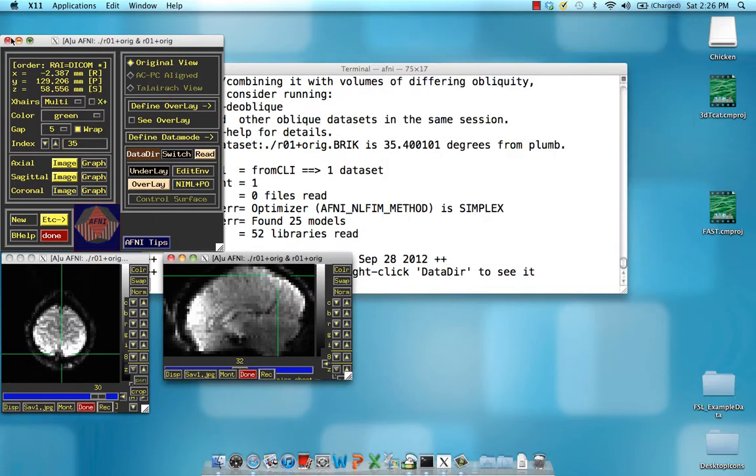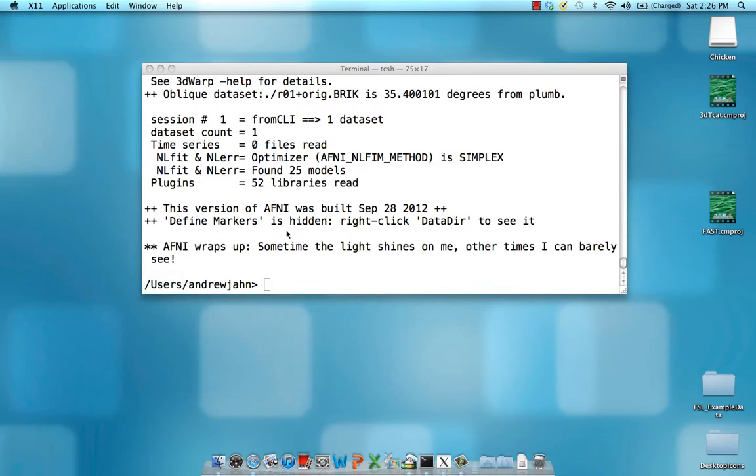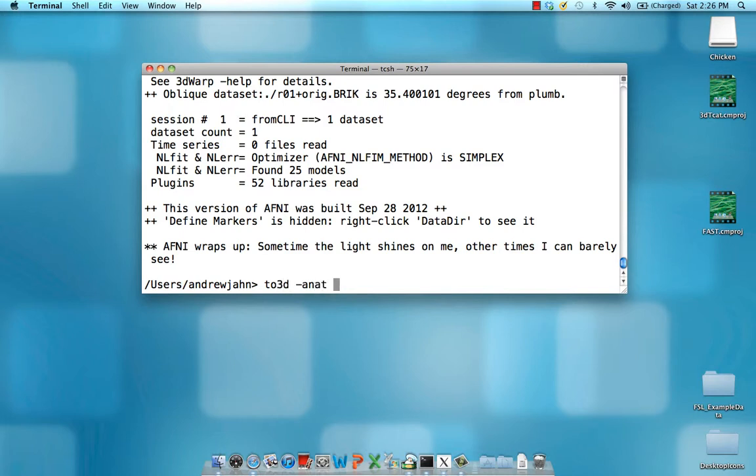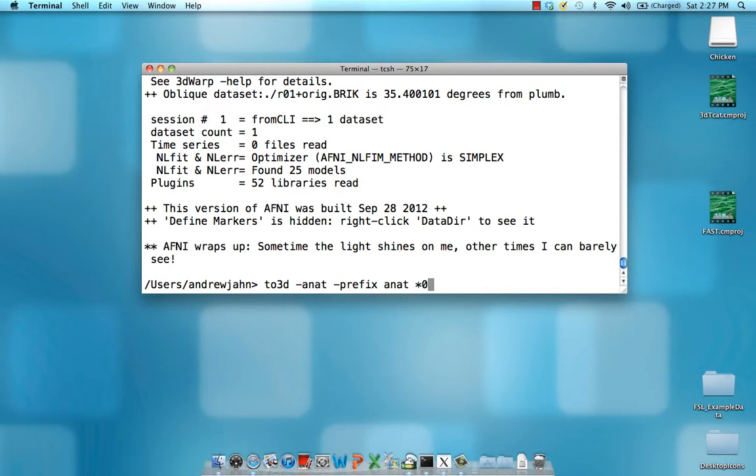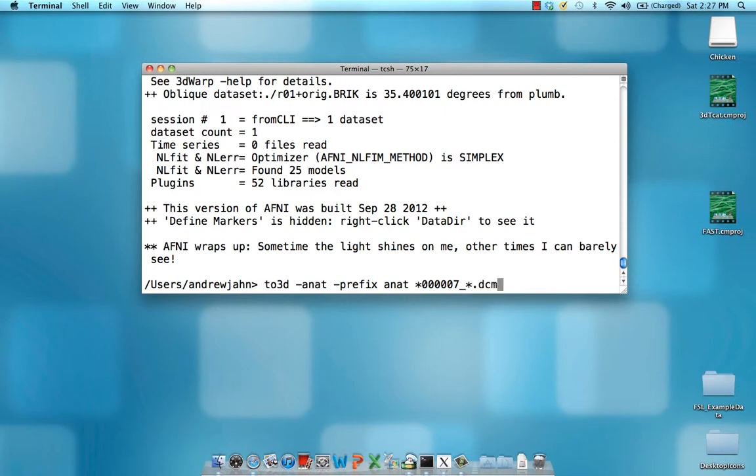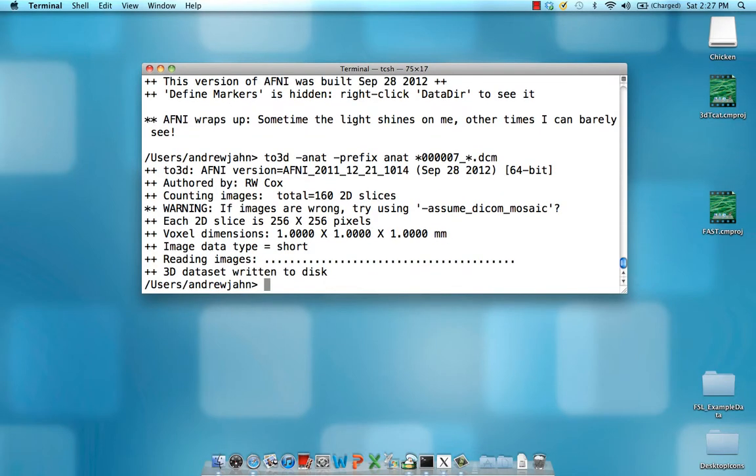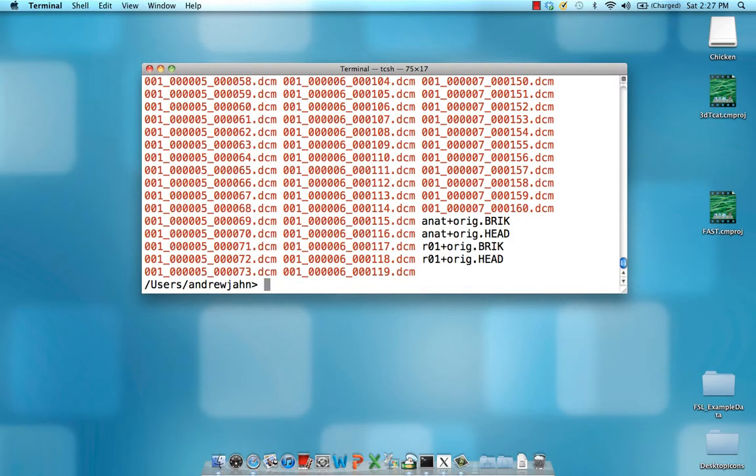Now we're going to do the exact same thing, the exact same logic, but to convert the anatomical data set, which requires fewer arguments and is more straightforward. All it requires is the command to3d and a -anat flag, which specifies that this converted data set is an anatomical data set. We can also have a prefix, which can be anat for the anatomical. And again, we're going to use these wildcards to only grab run number seven, which if you recall, I mentioned before was the anatomical run. So five zeros and a seven underscore, another asterisk and then dot DCM. So it's already done. It's already converted that.